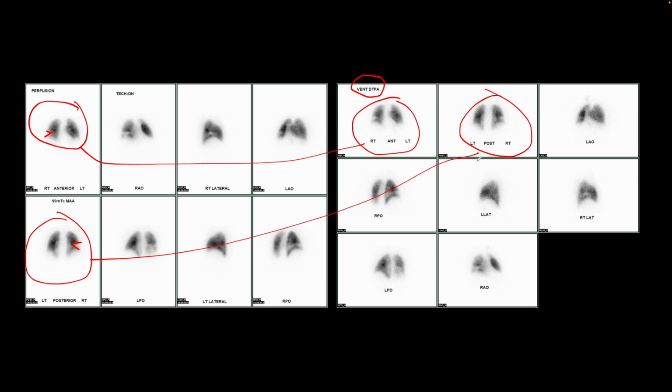Attention to detail in nuclear medicine procedures is very important, and if we don't pay attention, then we get into the situation of what they call garbage in, garbage out. We may not know what we are missing or how we are adversely affecting patient care. And so it may not take much time to move from nuclear medicine to unclear medicine.